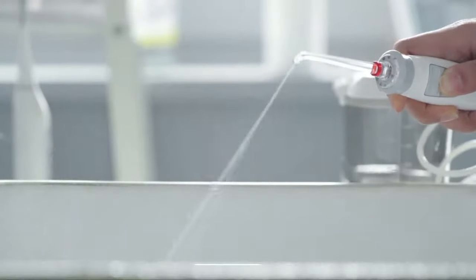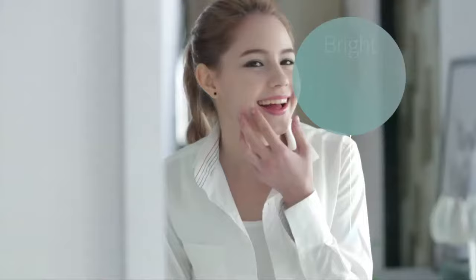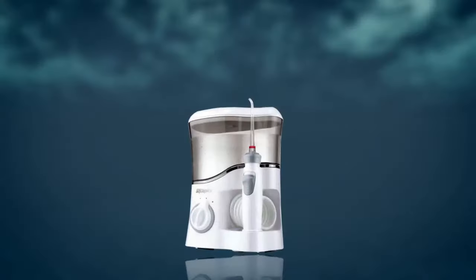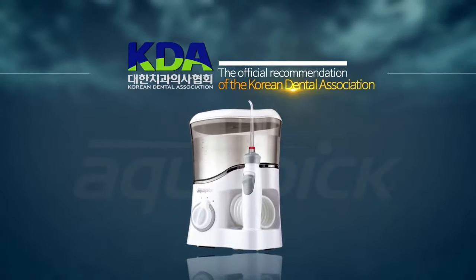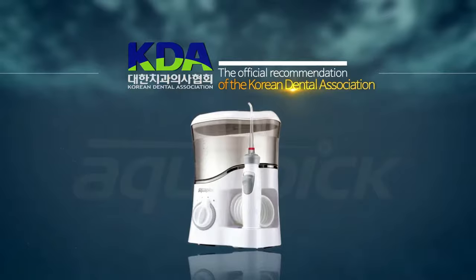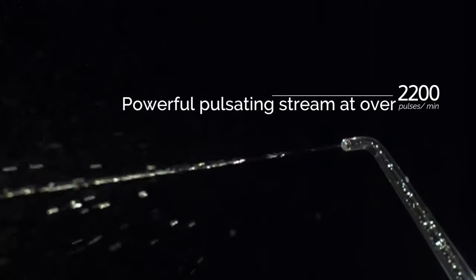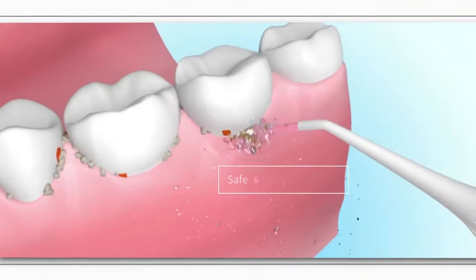there is a solution. If you want a cool and clean feeling after brushing, for the brightest and healthiest smile possible, introducing Aquapik — the official recommendation of the Korean Dental Association. No more weak ordinary streams of water. Aquapik offers the most powerful pulsating stream at over 2,200 pulses per minute.